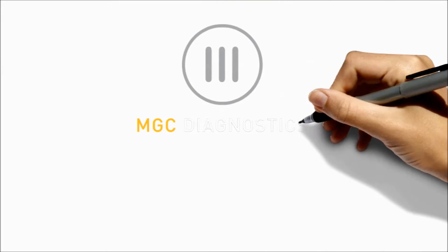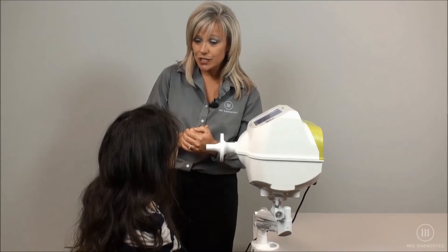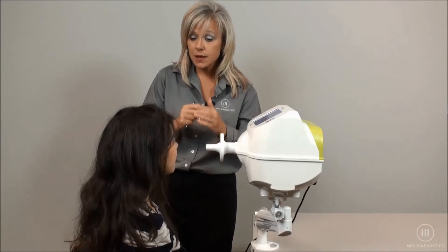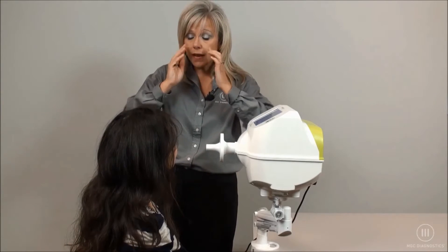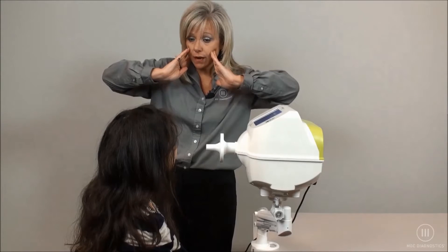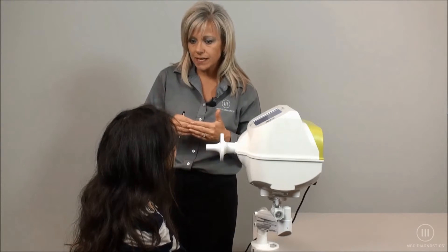Welcome to the MGC Diagnostics Resmon Pro FOT training video. You're going to put your mouth on the mouthpiece with a tight seal, with your neck slightly flexed, nose clip on, hands on your cheeks, and your elbows out. You're simply just going to breathe normally for approximately 15 breaths.